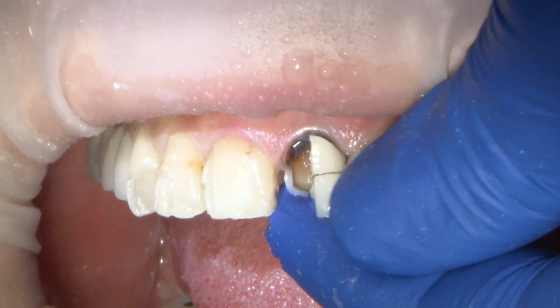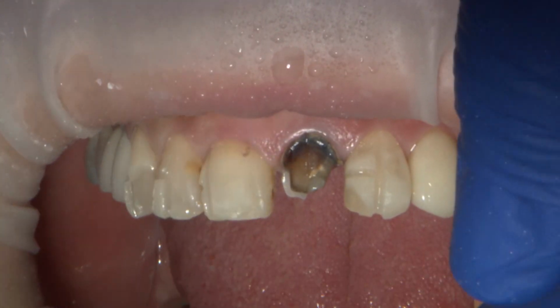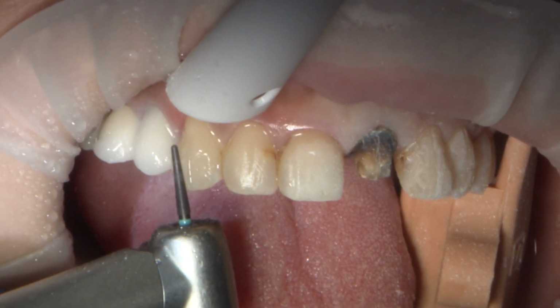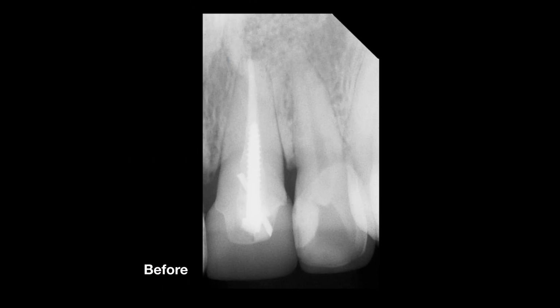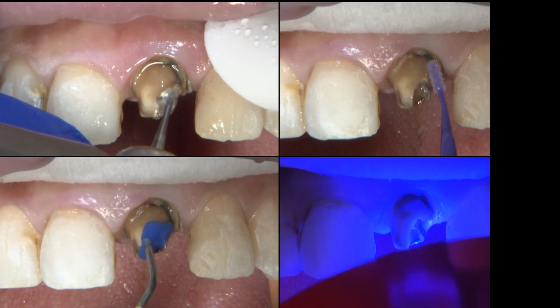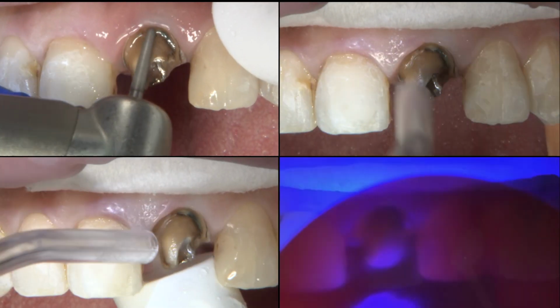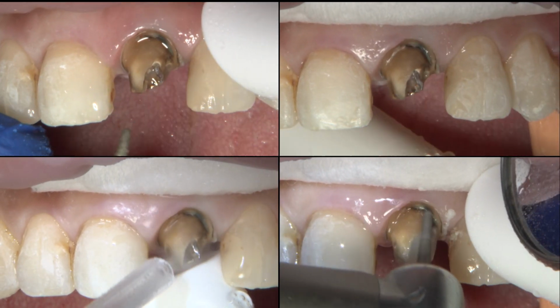After removing the previous crowns on tooth number 9 and all remaining PFMs and veneers, we can see significant marginal leakage and caries that needed to be eliminated. But I was happy to see that some of the underlying enamel was still intact. Patient's tooth number 9 had been previously treated with a root canal therapy and featured a dark discoloration. Tooth number 9 was cleaned and rebuilt up to proper form using a dual-cure reinforced core material.